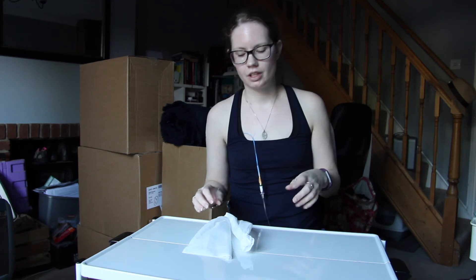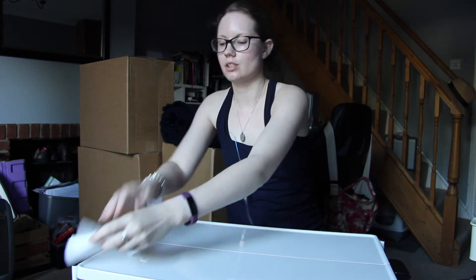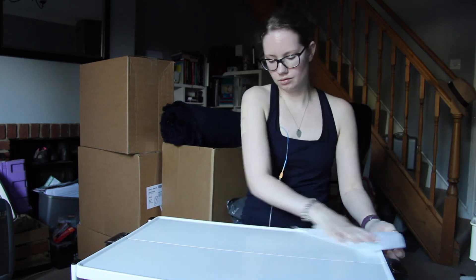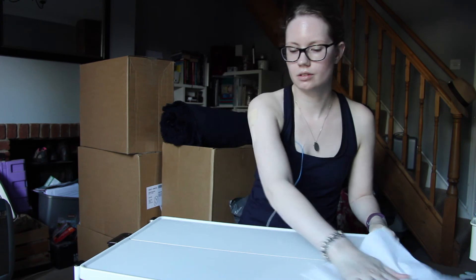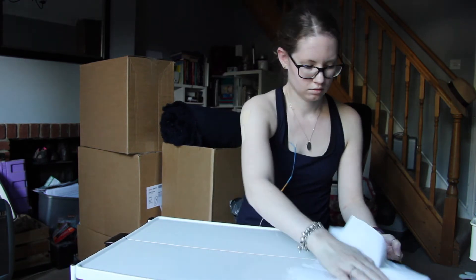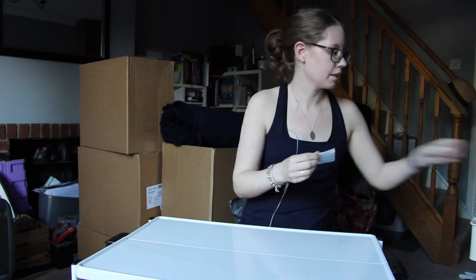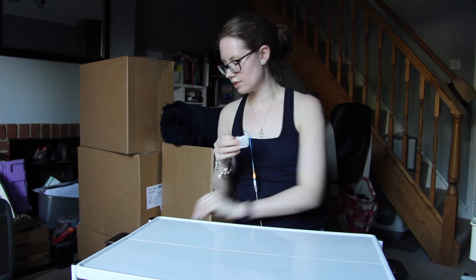Hey everyone, so my fluids are finished and I'm going to just go through my disconnection. So again, we need to wipe the table down with the detergent wipe, then dry it with some paper towels, then take the sanicloth and clean the surface again.